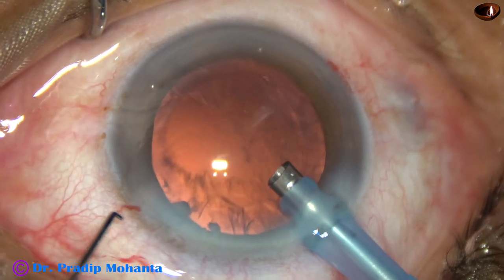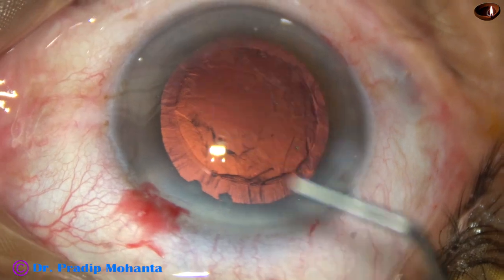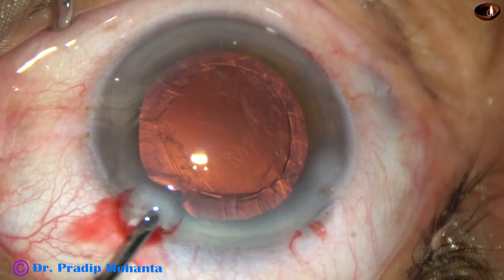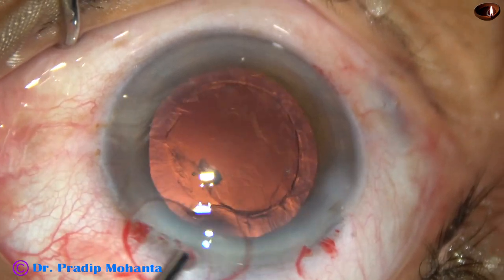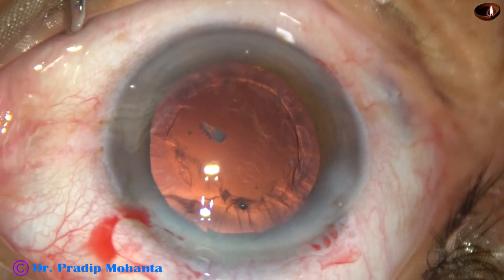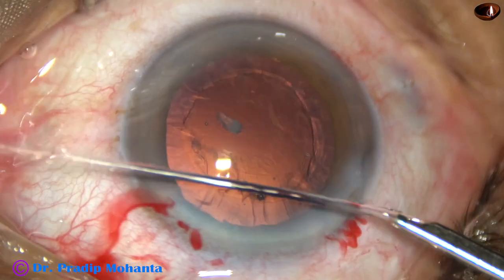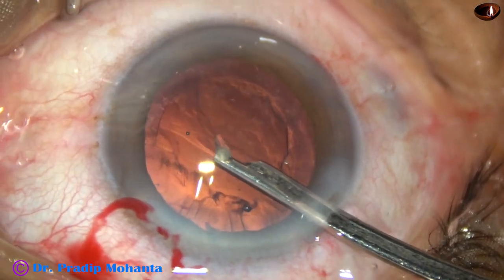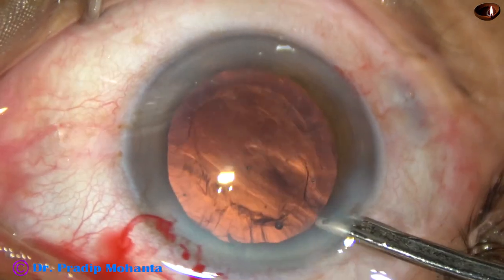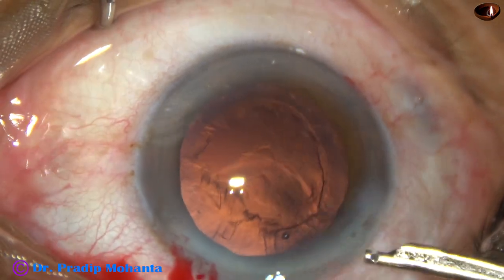And now there are some nuclear bits near the left side port. So I am going to remove these nuclear bits before I start aspirating the cortical matter with bimanual irrigation aspiration. I ask for Simcoe — just go near the nuclear bits, apply very little vacuum, hold the nuclear bits and just scoot them out of the anterior chamber.